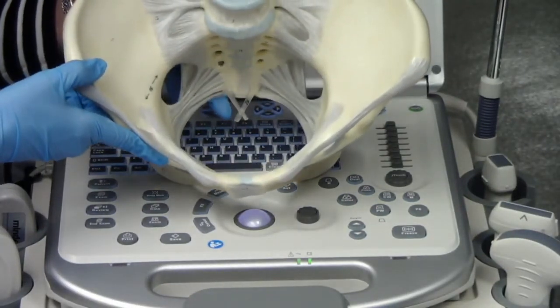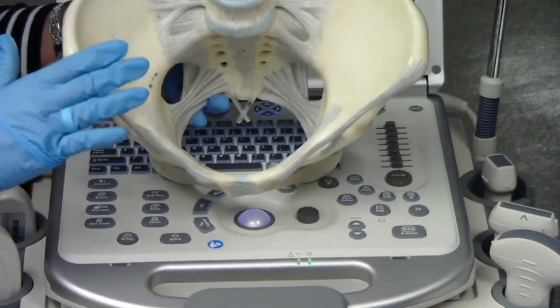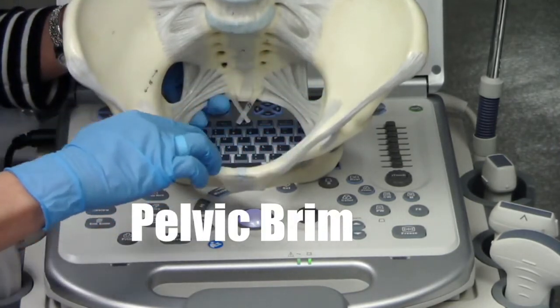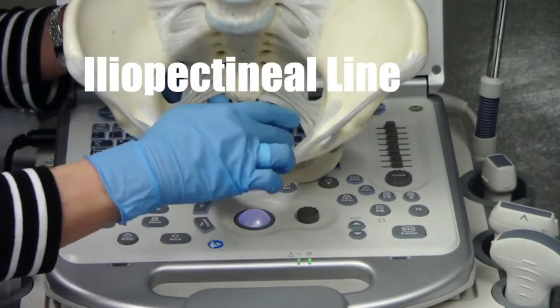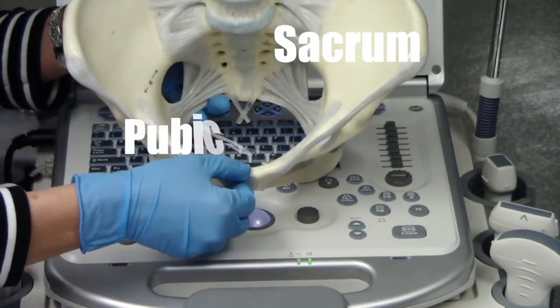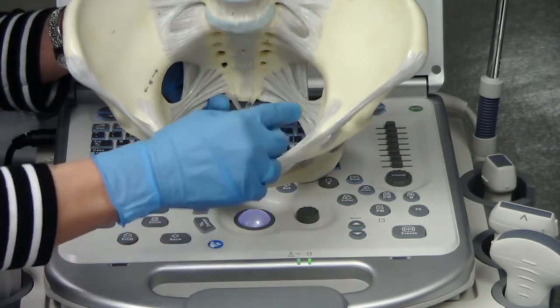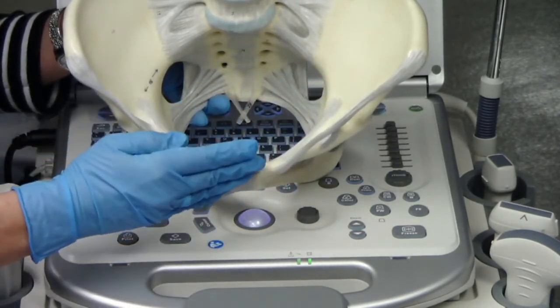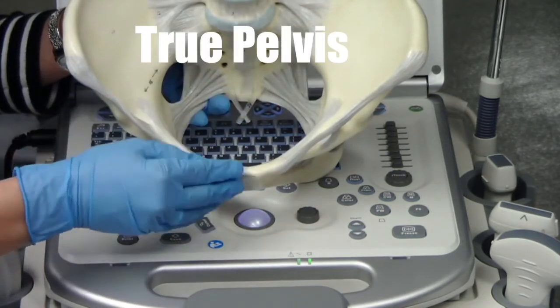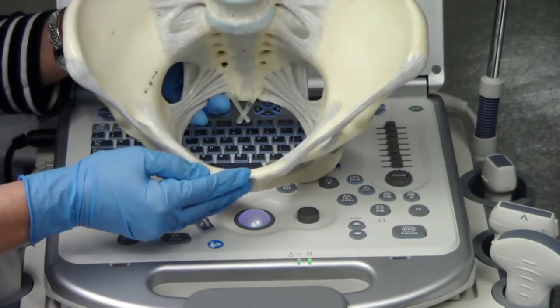If you recall, the true pelvis lies below the pelvic brim. We have the iliopectineal line, and then of course we have the sacrum to the back, pubic symphysis, and pubic bones to the front. And this creates a line, and down inside is our true pelvis, where our bladder and our reproductive organs live.